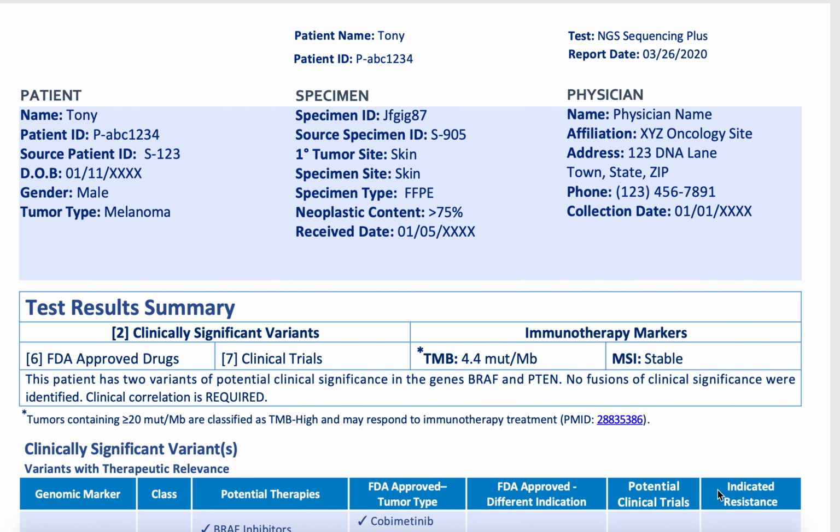In this video tutorial series, we will walk through sections of a sample patient report detailing the outcome of next-generation sequencing on tumor tissue. Somatic tumor testing provides clinicians with information to help them formulate a treatment plan tailored to a specific patient based on their genetics.